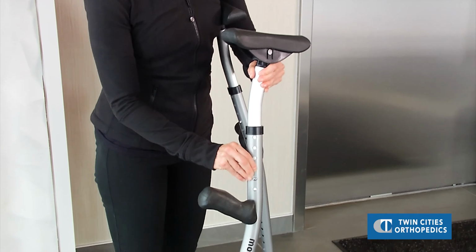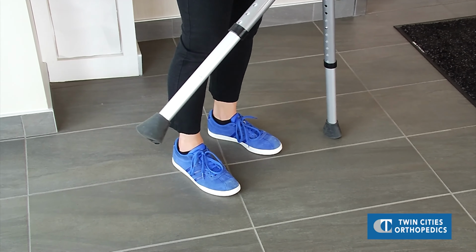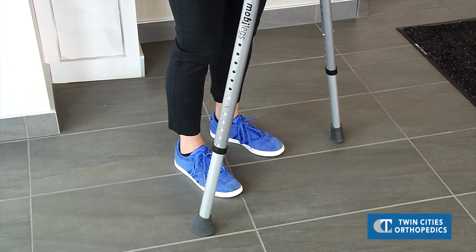If you need to readjust the top to get the hand grips at the correct height, make sure you readjust the bottom half so that it's still at the correct height overall.